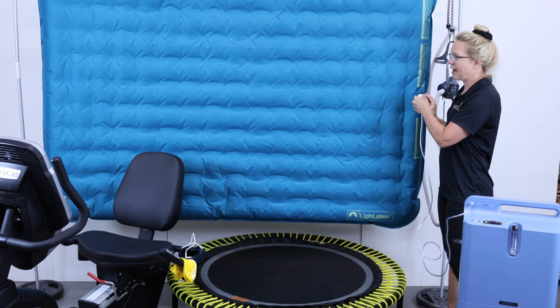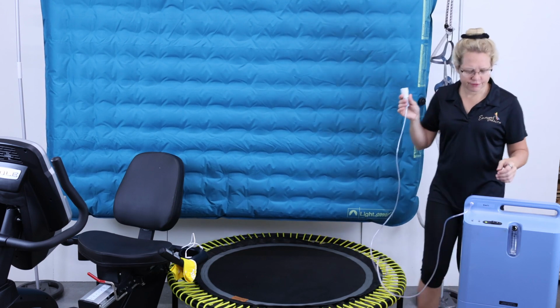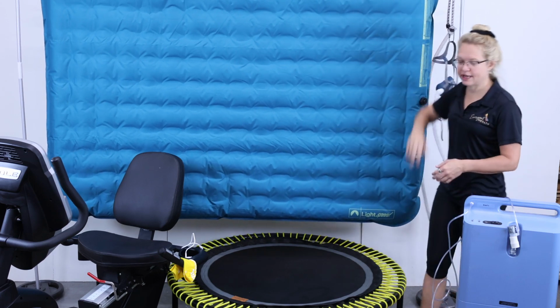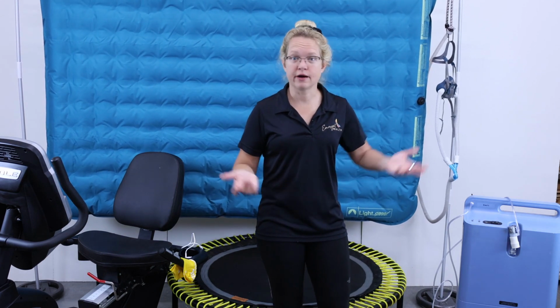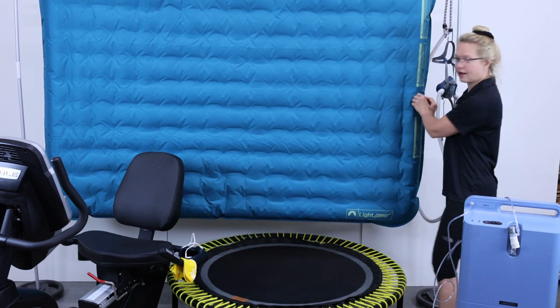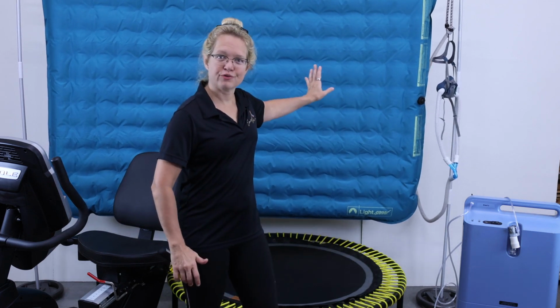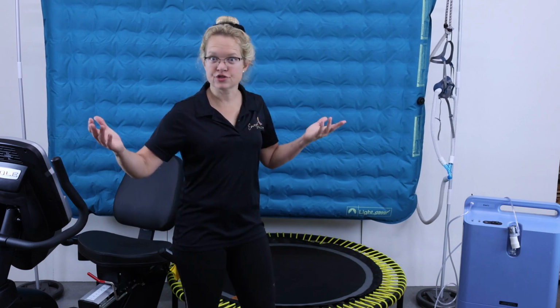And then, for this one, it takes about 35-40 minutes for it to fill up to about this full. And some people use two. If they're going to exercise longer, they'll have two mattresses hanging up and fill up both of them. And you can do it hours in advance. You can fill it up with oxygen, and then you just put the cap back on as quickly as you can, and then it's ready to go for when you want to exercise. So once your mattress, or your concentrated air reservoir, is full, then you're ready to exercise.